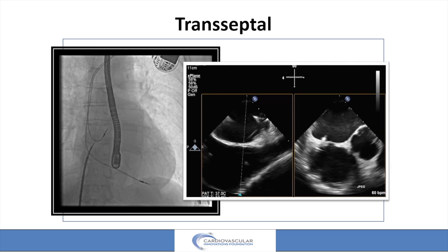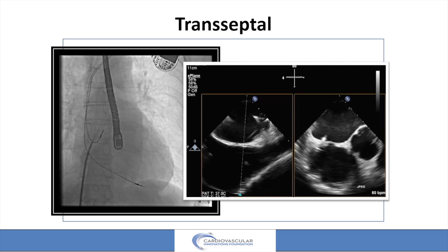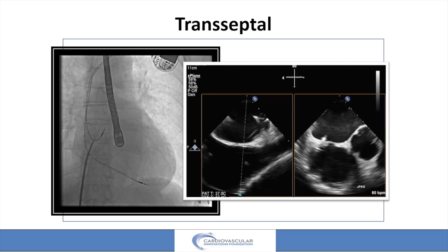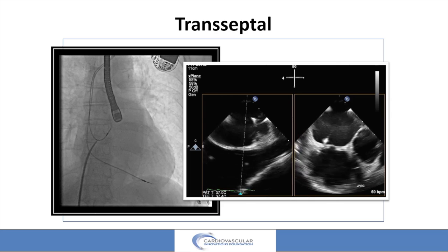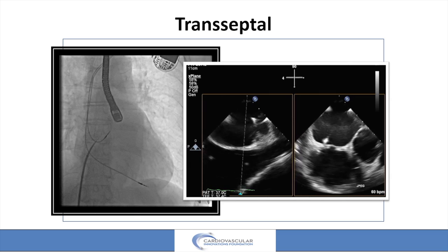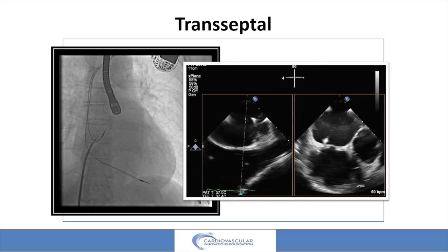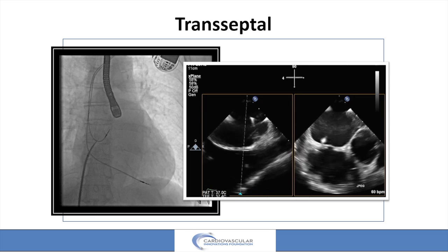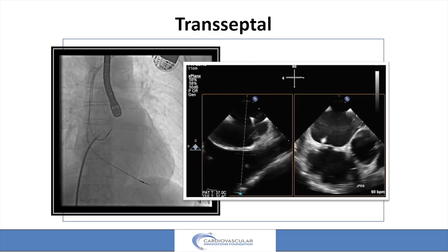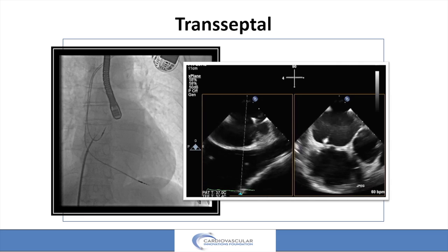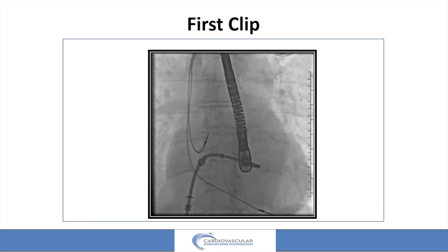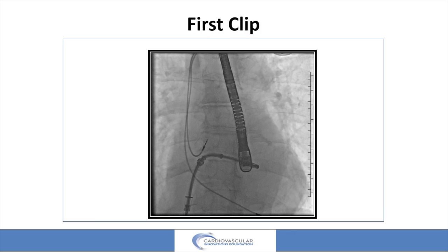Transseptal in these cases — when you're really dealing with something very medially — it's very important to get height. In this particular case, I actually had to stick the secundum to get enough height. You can see this in the short axis coming through the secundum. I go mid or mid-low — for these very medial cases, I don't go high in the septum, but lower than that. But lots of height in that left atrium chamber. Everything's going smoothly, we are just rocking along.